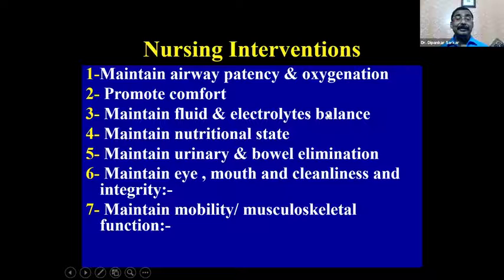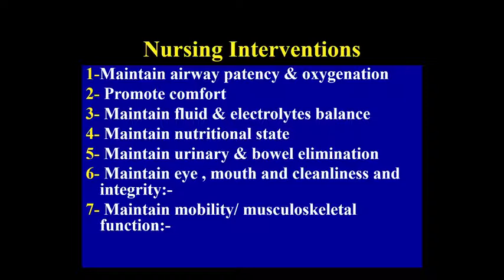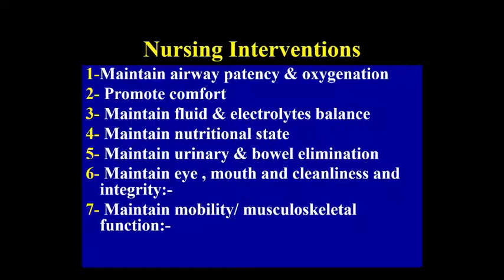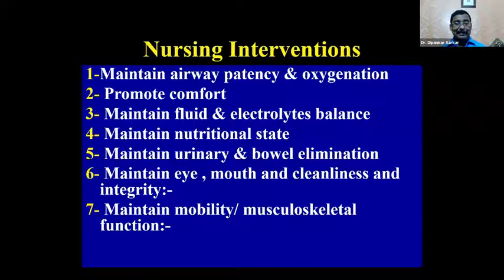Now, what nursing intervention is required? Maintaining the airway patency and oxygenation. Make sure the saturation is all right. There is no sound in the airway, so the airway patency is maintained. And as and where required, you do suction. Promote comfort. Do not make the patient uncomfortable on ventilation. Communicate with the patient if the patient is conscious, or look at other signs where you can understand the patient is comfortable. The fluid and electrolytes should be checked and communicated with the treating team. And if there is any discrepancy, with the help of the treating team, try to correct it.